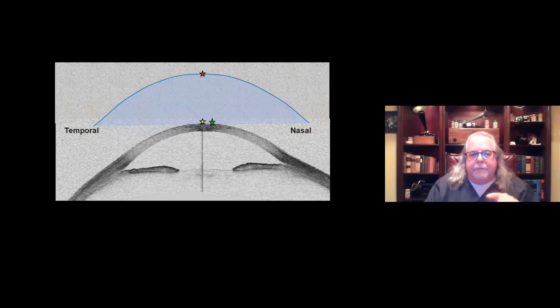We've marked the geometric center of the cornea, and over on the right in the green, we have the human line of sight, exactly where you want that optic to position, not in the center of the cornea, but over the line of sight. Now, watch as the scleral lens drops down. You'll notice here right away that the sclera is shaped very different on the nasal side versus the temporal side.